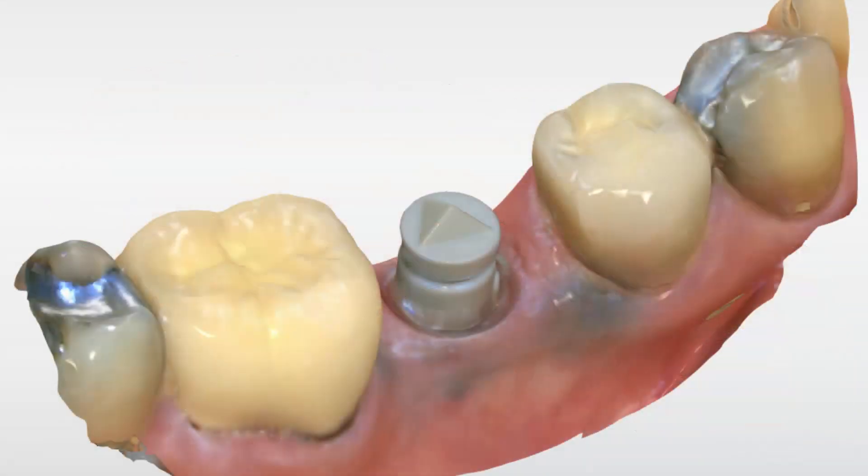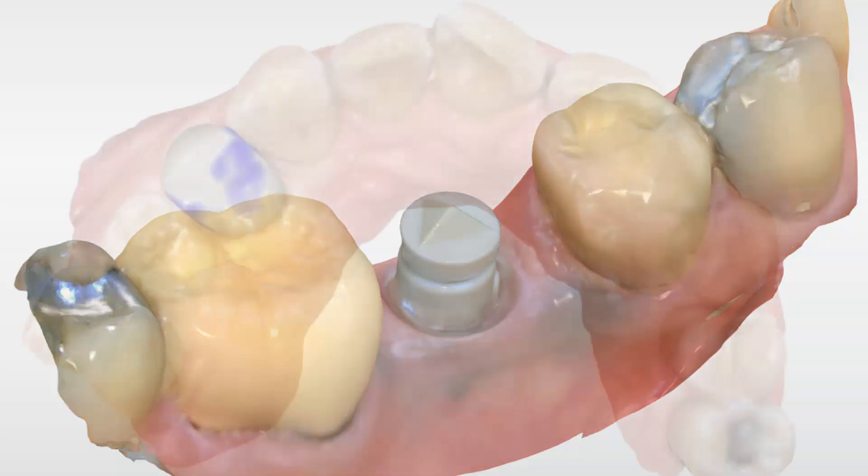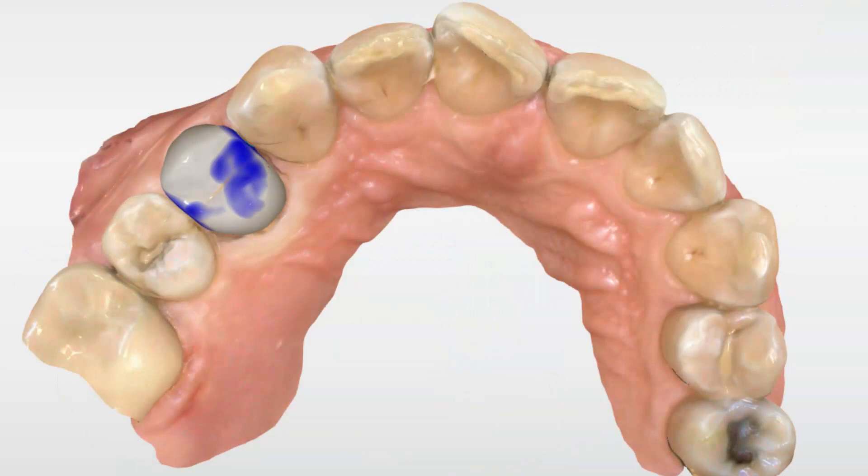The PrimeScan has also allowed the capture of all proximal contacts without hardly any tilting of the camera. This advancement greatly increases efficiency when scanning. Finally, the proposals are even more improved than before, rarely requiring anything more than the most minor adjustments.